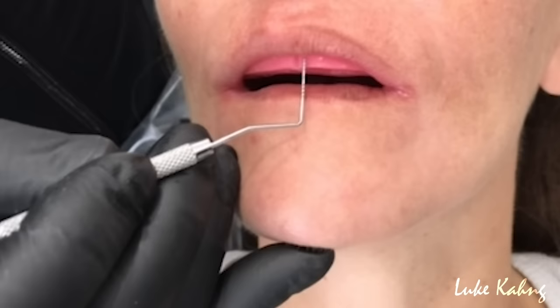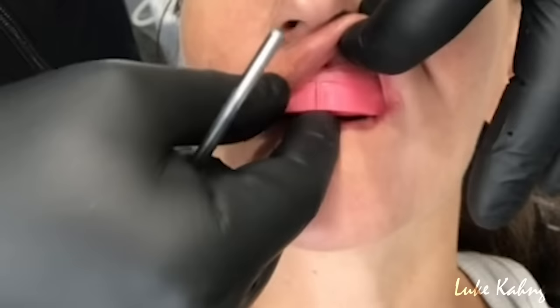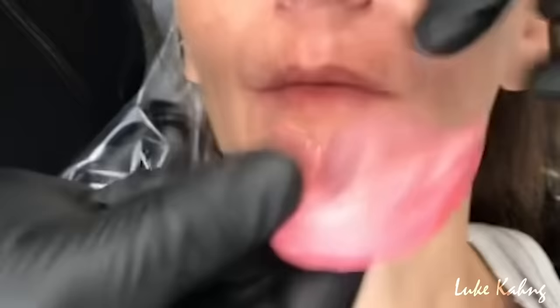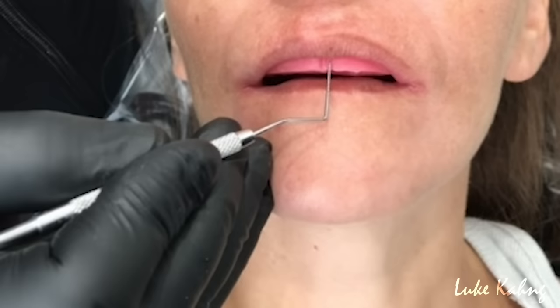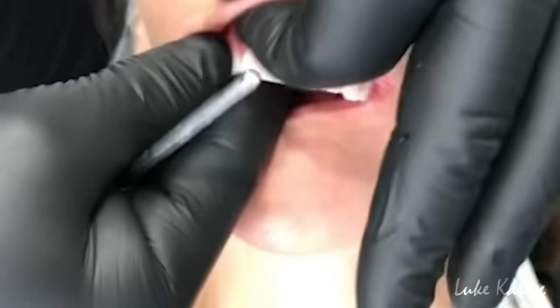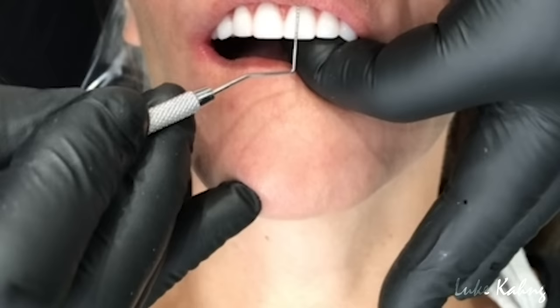Relax your upper lip. See here, I'm showing 3 millimeters from the lip that's relaxed. This is the one that we initially sent. So we have a distance of about 3 millimeters from the edge of the lip. See that right there? I'm seeing 3 mils on the wax up. When she's even relaxed, I'm getting 9 millimeters. So it's a 5 to 6 millimeter difference where these teeth need to go up.